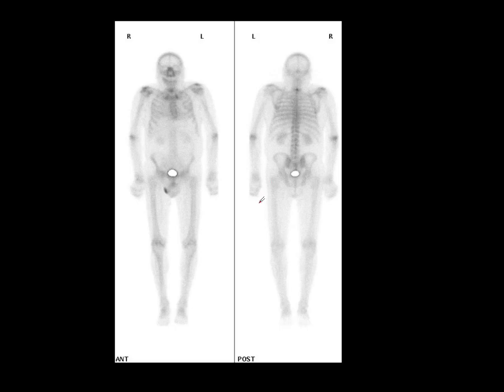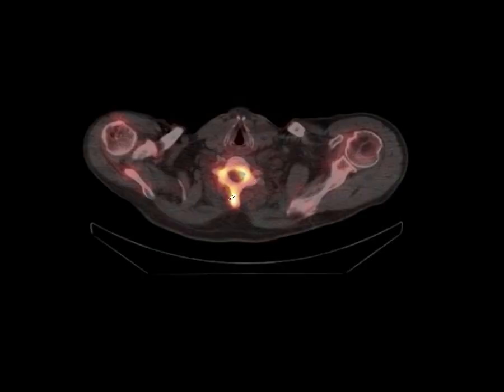When Paget's disease affects the vertebrae, it usually tends to affect the whole vertebra. This patient had a prominent posterior neural arch, so we did a SPECT-CT, which shows diffuse uptake — the classic appearance for Paget's disease. This would be quite unusual for metastatic disease.